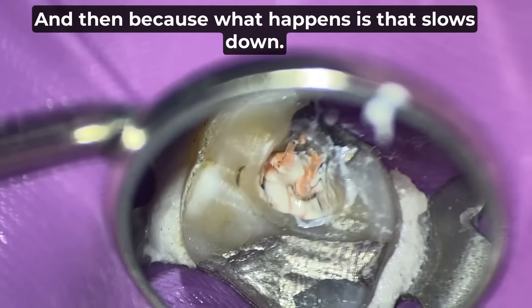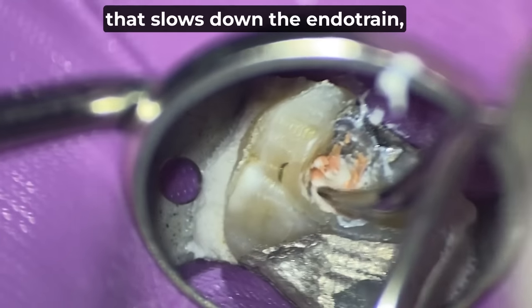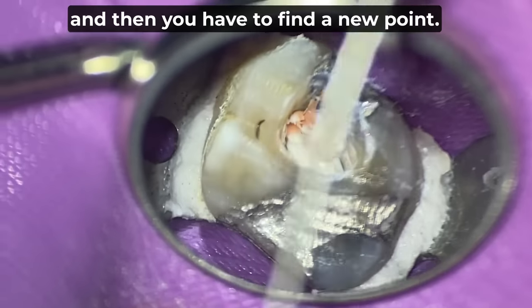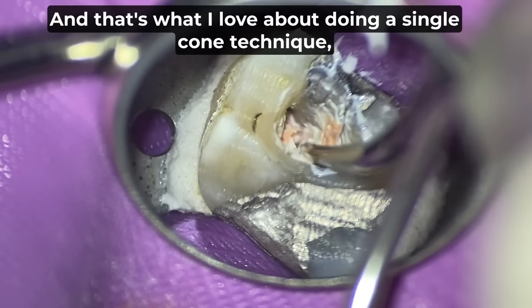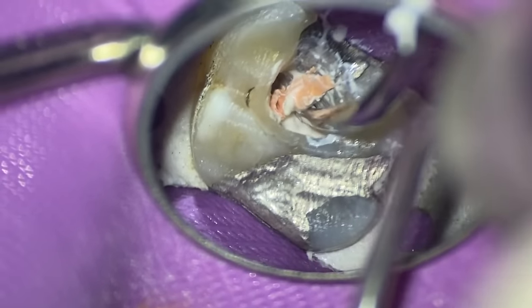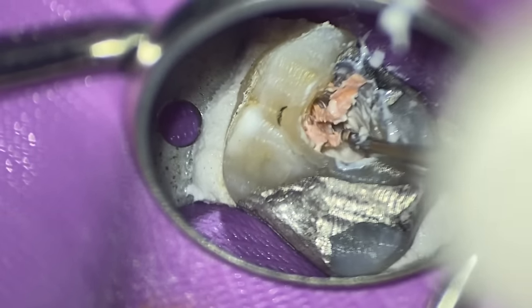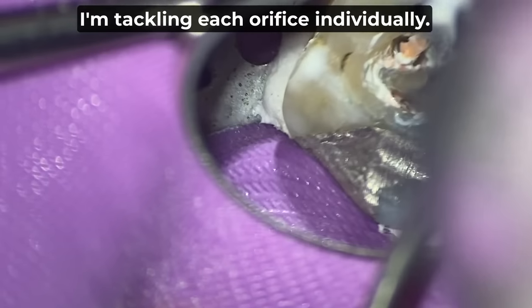Because if you pull that all the way out, that slows down the endo train. The endo train comes to a grinding halt, and then you have to find a new point. And that's what I love about the single cone technique, especially with an apical stop preparation: I place a cone to length, boom, that's it. So what I'm doing here is I'm tackling each orifice individually.